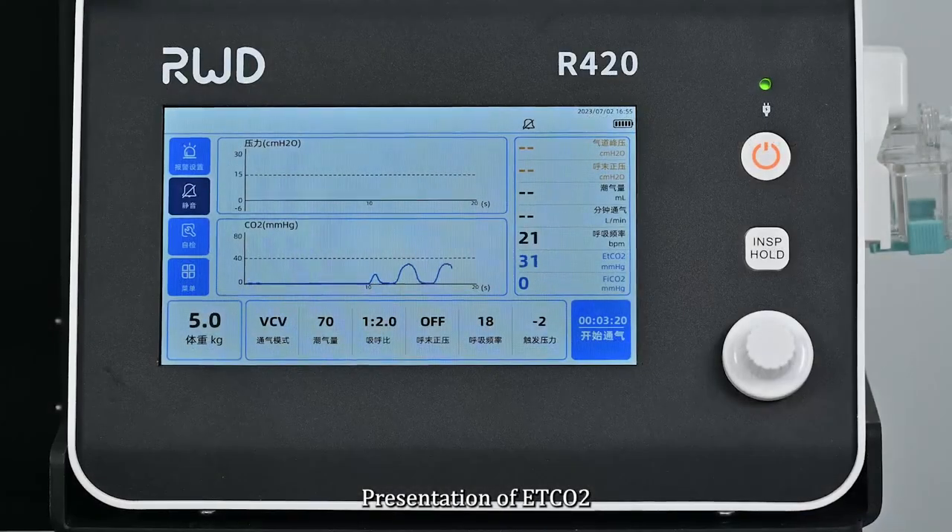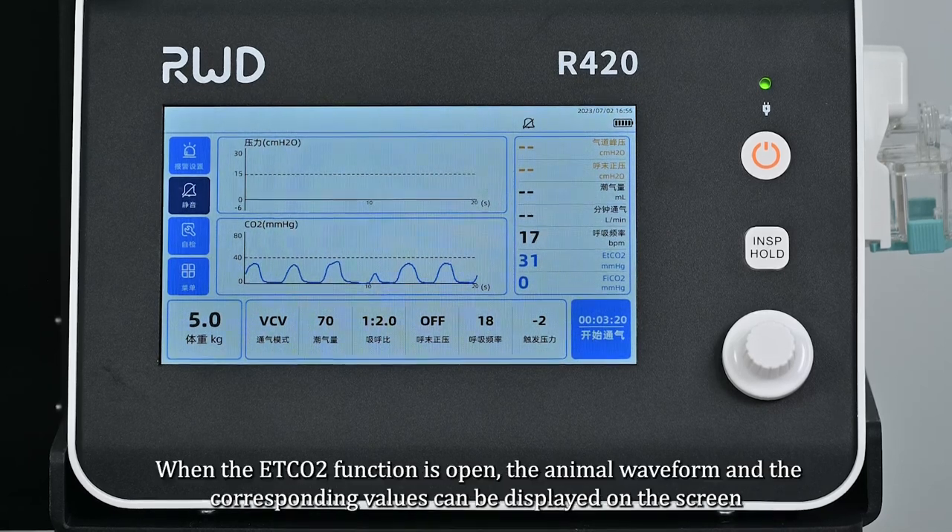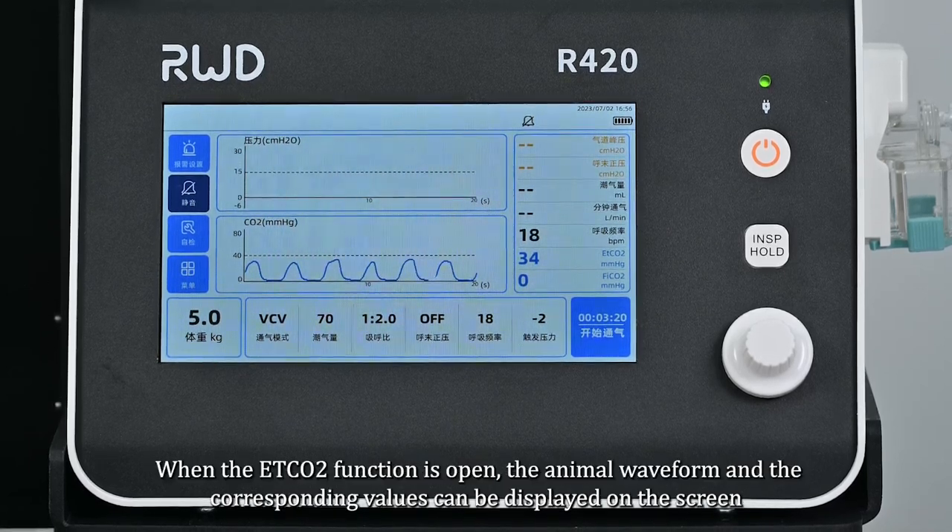For ET CO2 presentation, connect the sampling tube to the interface. When the ET CO2 function is active, the animal's waveform and the corresponding values can be displayed on the screen.